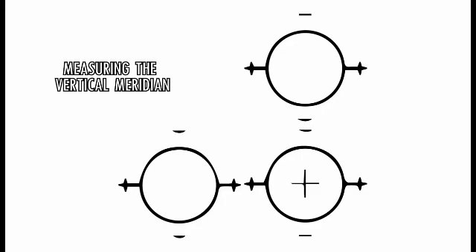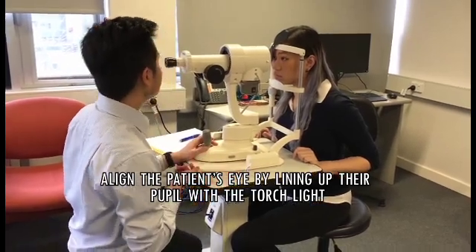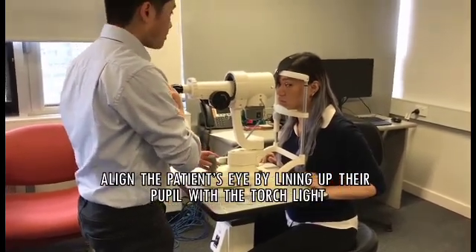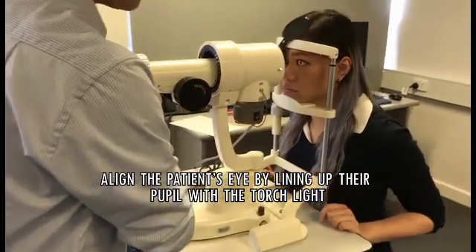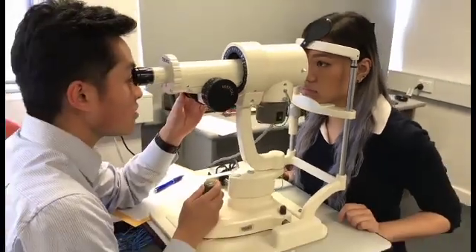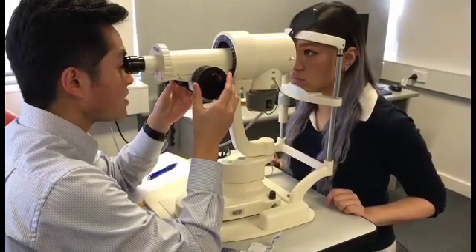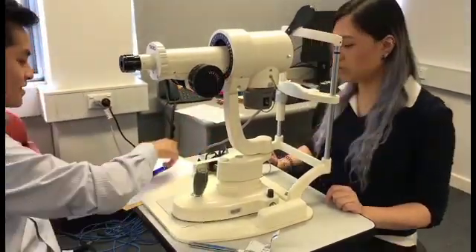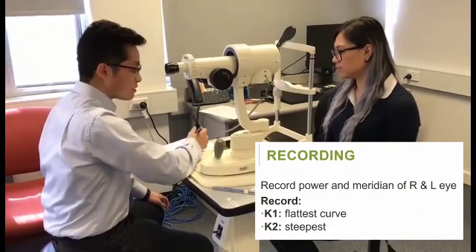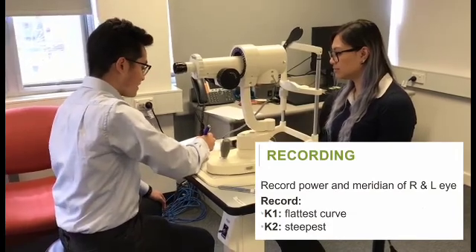The plus sign of the central focusing circle will be doubled. The clinician then further aligns the machine with the patient's eye using a torch. Make sure to record the power and meridian of both eyes. Your K1 reading will be the lowest number, representing the flattest corneal curvature, and your K2 reading will be the highest and steepest.